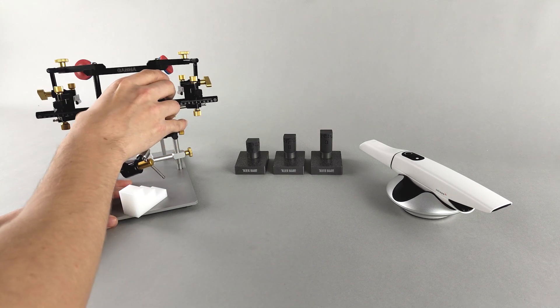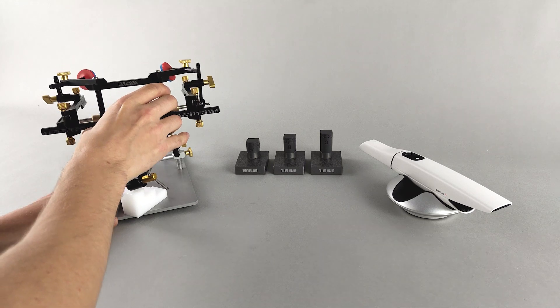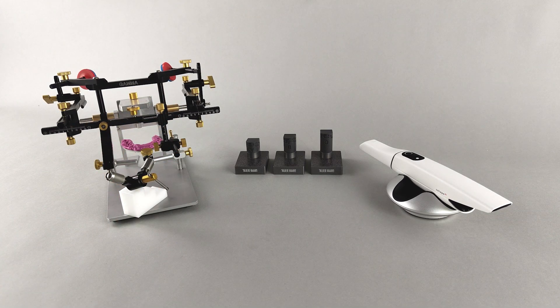The face bow with the bite fork still attached is removed from the patient's head and mounted in the upper jaw transfer stand. The bite fork is thus correctly positioned relative to the exact hinge axis, and you may proceed with the digital workflow.